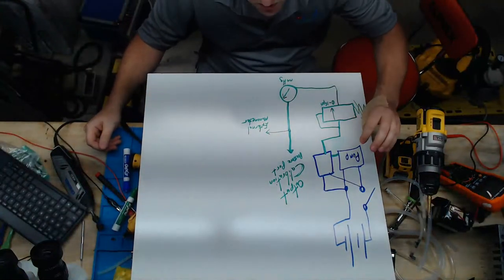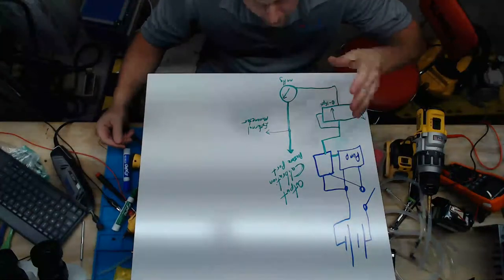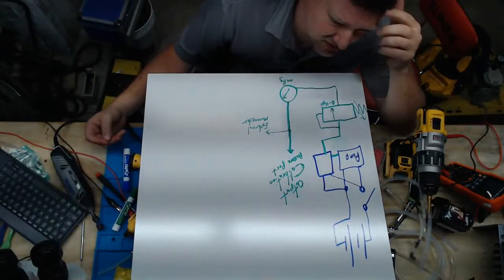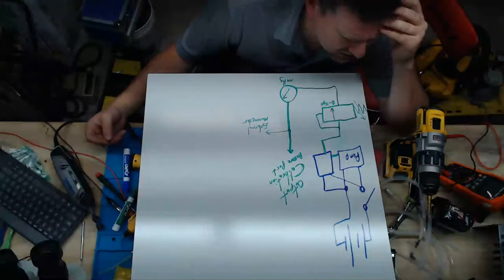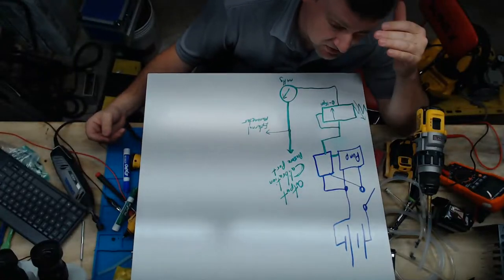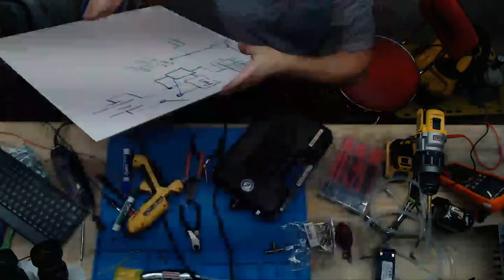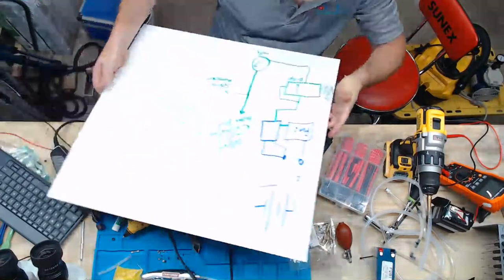So we need that pressure boost because these tiny, tiny little pumps, we need them to get up to 15 to 20 PSI. So the highest pressure I think I've seen on a medical device to calibrate is like 475 millimeters of mercury. Or is it 750? Might be 750 millimeters of mercury. Anyway, if I remember right, it comes out to like 14.5 PSI. So that's why I have my 0 to 15 PSI regulator on here.